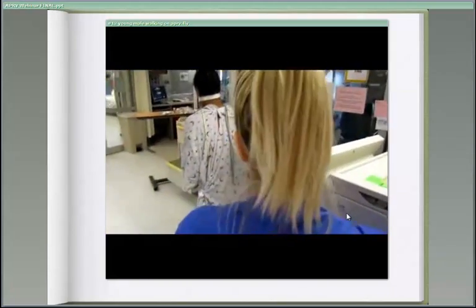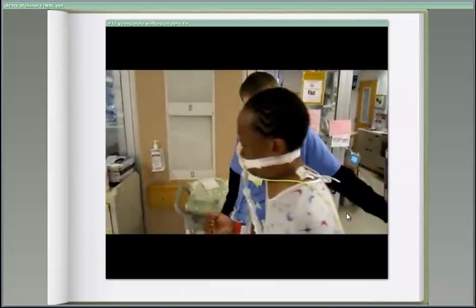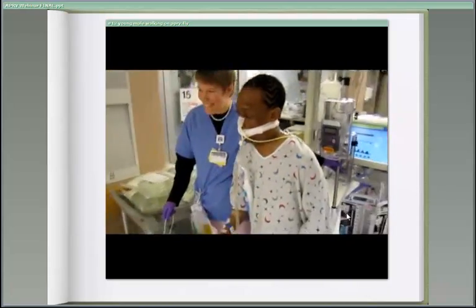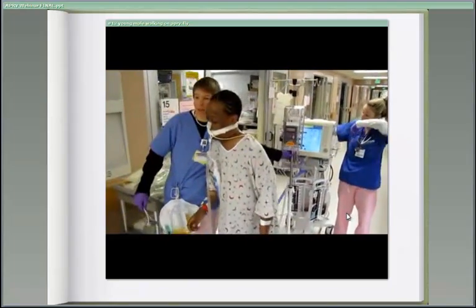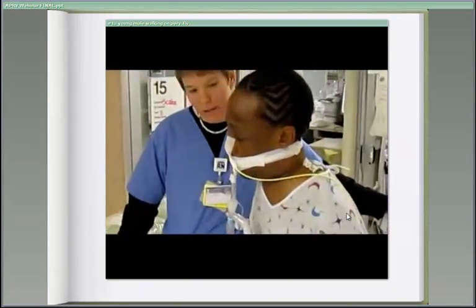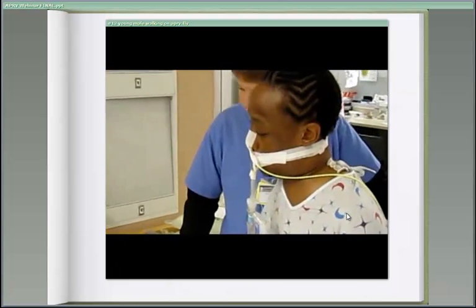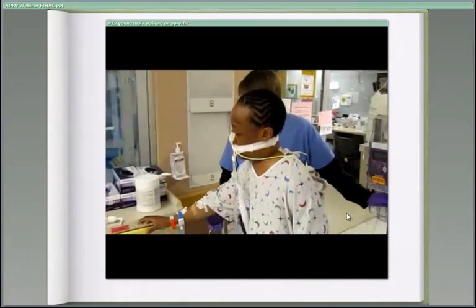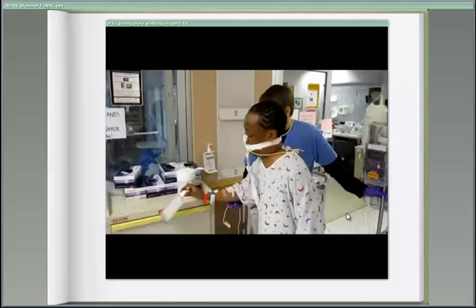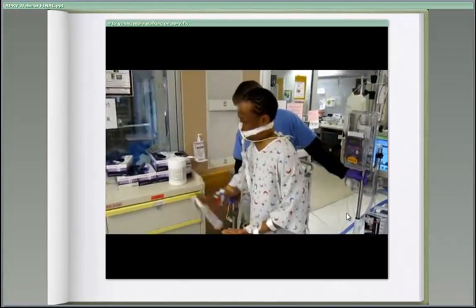You can see behind that this particular patient has a PCA pump for pain, and has chest trauma. You're going to see in a minute some chest tubes. They're actually on the ventilator. The patient has bilateral chest tubes. And so this is one of the ways we use APRV, of course, is that it allows patients to be quite flexible in ventilation. In fact, this patient's going to go ahead and clean their own hands, which is always a good thing.